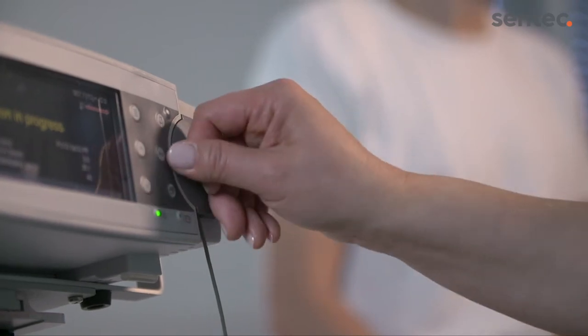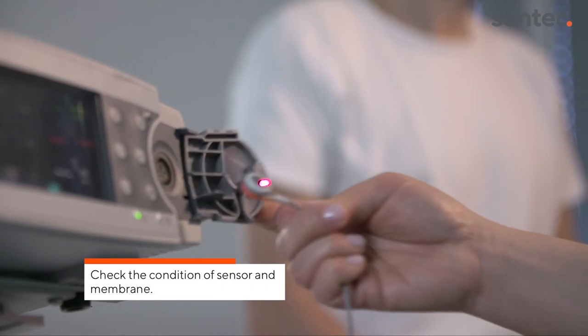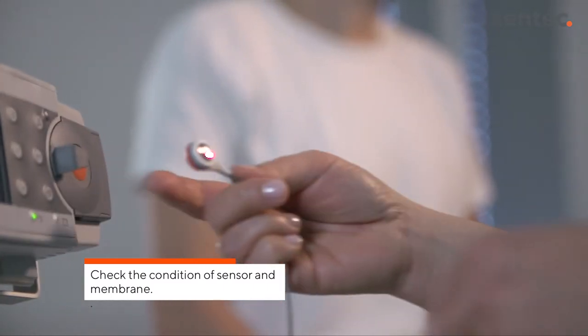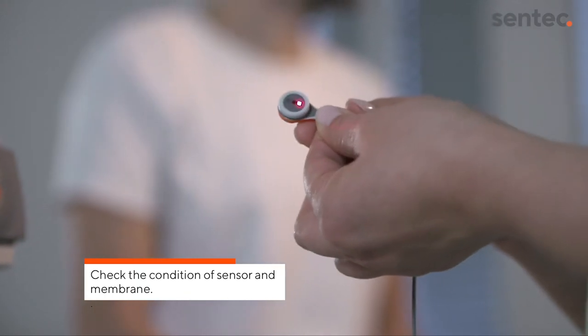Remove the sensor from the docking station, grabbing it at the neck. Check the condition of the sensor membrane and the integrity of the sensor. Do not use the sensor if any problems are noted.